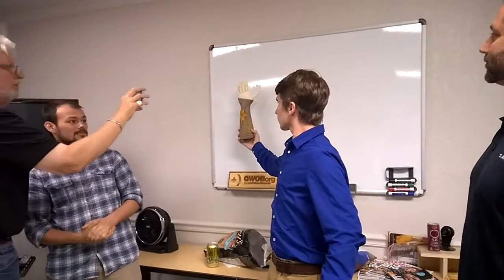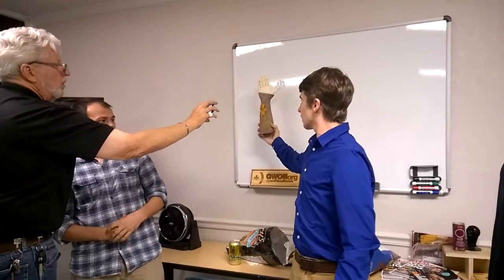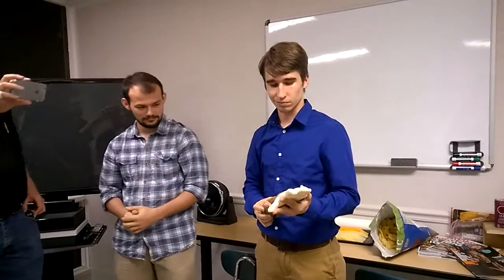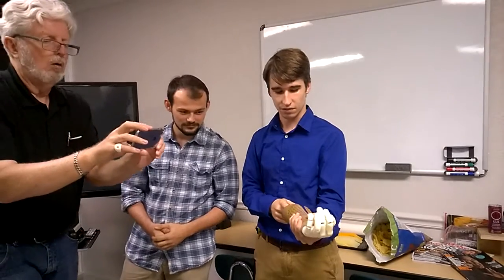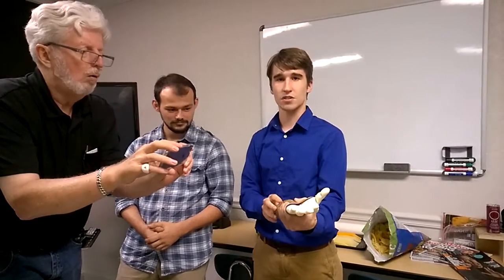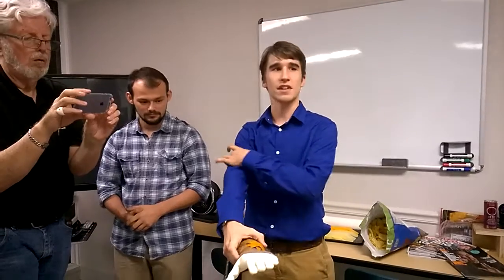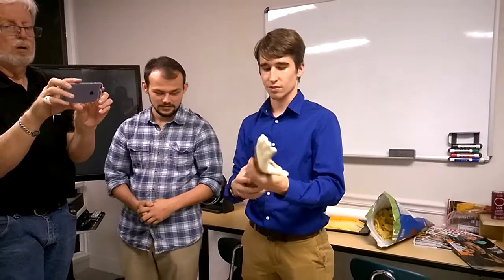We also wanted to add some designs onto it because it's for a little girl — she's about five or six and she likes flowers, so we had him add a flower onto the design. If you pull these strings back here, you can see the hand closes. That's pretty cool. This would be actuated electronically by a high-torque servo. She's going to control it by electrodes hooked up to her bicep — whenever she flexes her bicep, it'll read that inside the arm and tell the hand to close or open.